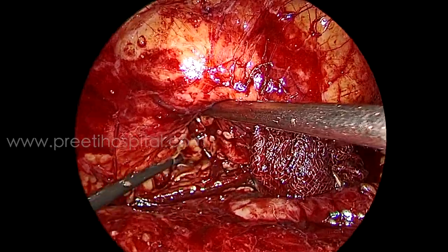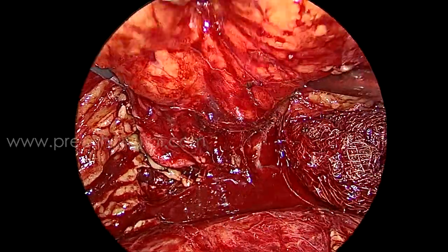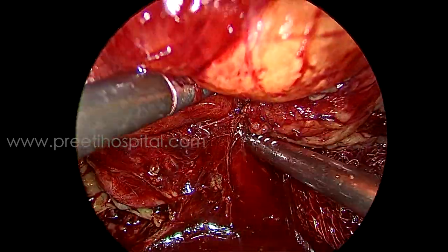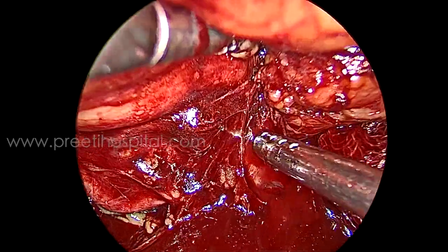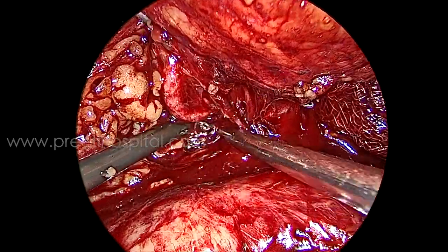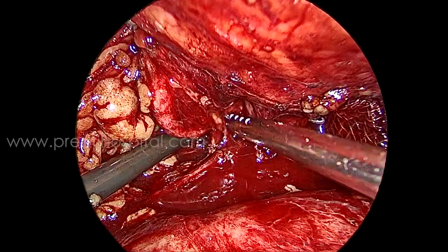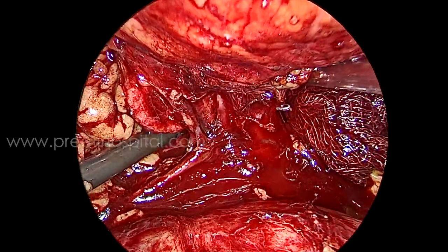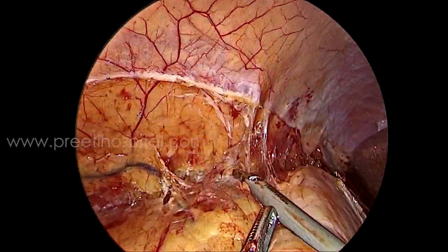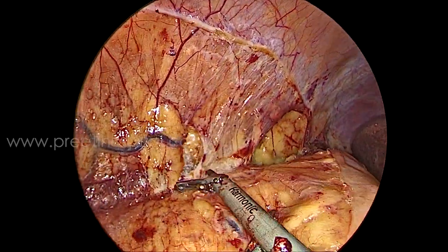That adrenal ooze was not the main thing we wanted to discuss. The main discussion point was the small bleeding at the hilum — a small clip was applied, but it didn't fully control it. The artery was very tortuous. We got clear control over the renal hilum with either mass clamping or individual clamping — that was not a problem.